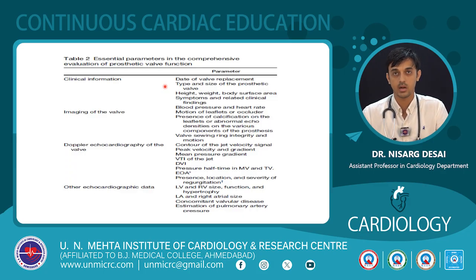What is the blood pressure and heart rate? The blood pressure and heart rate further play an important role in knowing the Doppler indices. If the heart rate is very fast, and at that point of time we are using the Doppler parameters, then there can be minor errors, so they should always be known.